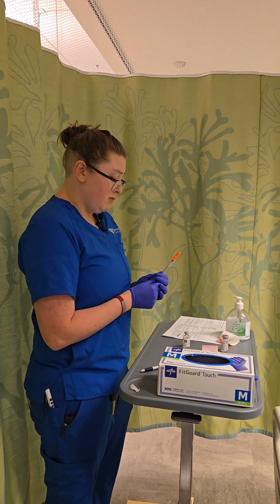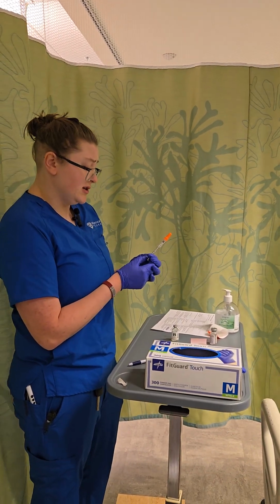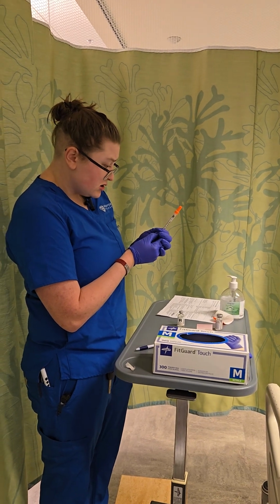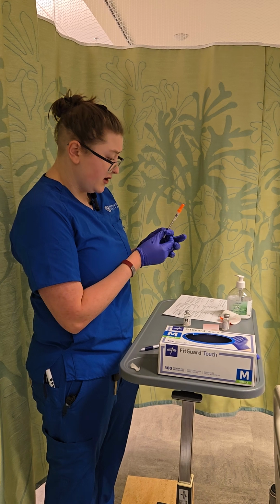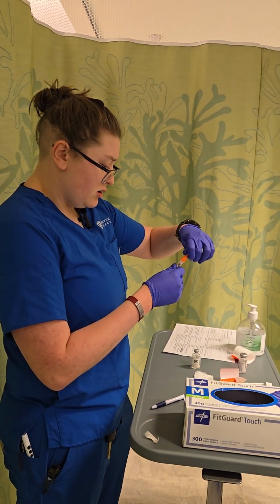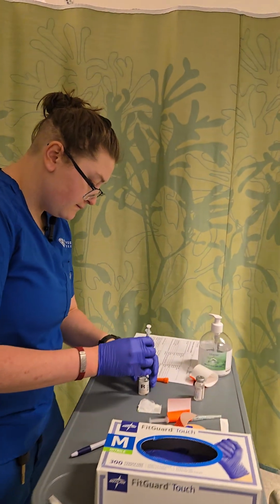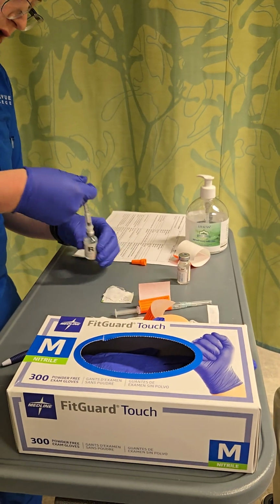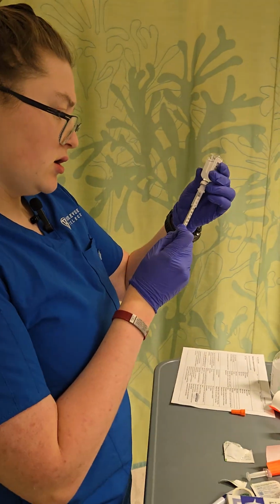All right, so the medication route and dosage for the insulin is subcutaneous, and that is 7 units. So I'm drawing up enough air to 7 units. I am now at 7 units of air. I will uncap. This is now dry. Air to air. Tip. Come back.